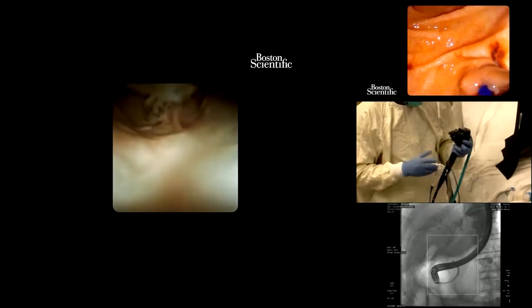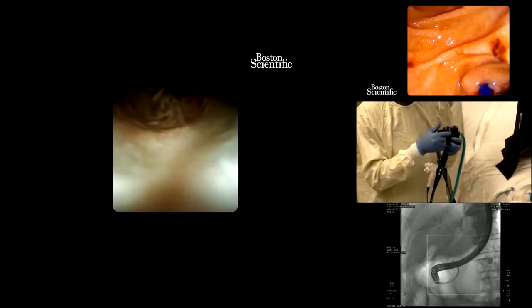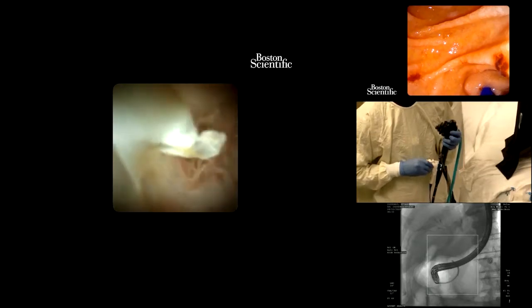That's right. So some more questions. One of the questions is, are we using SpyBite Max? That is correct. Yes, we're using the new SpyBite Max biopsy forceps. Does the SpyBite Max feel more stiff than a regular SpyBite? Not actually. It is possible that if I use a SpyBite Max in a regular reusable duodenoscope, maybe there is some stiffness. But as you can see here, I've got no problems navigating the SpyBite Max through the cholangioscope, with the more stiff single-use scope. It actually makes single operator cholangioscopy biopsies or interventions much, much easier. I have no resistance getting the accessory out each time.